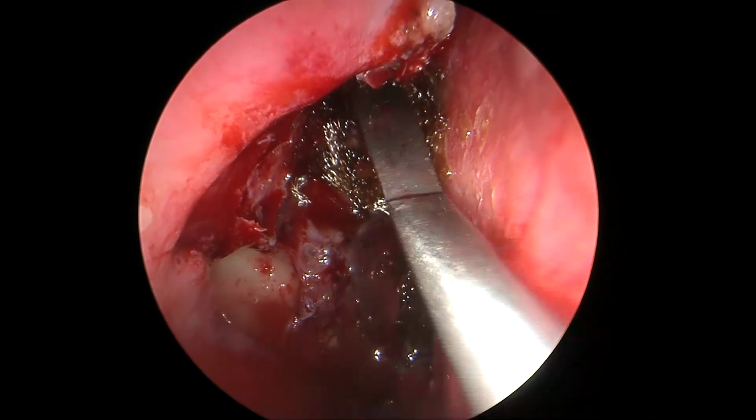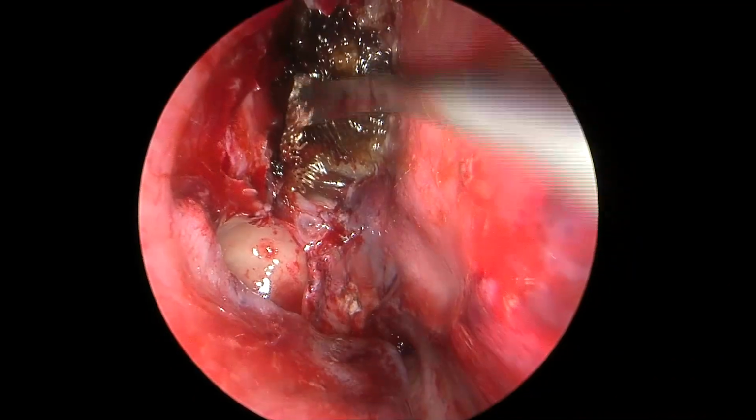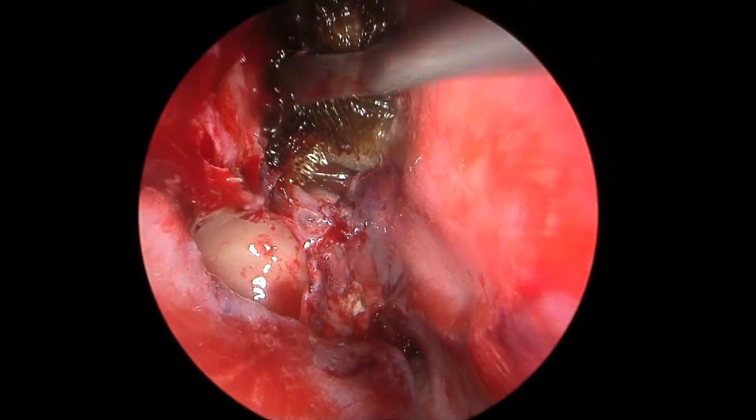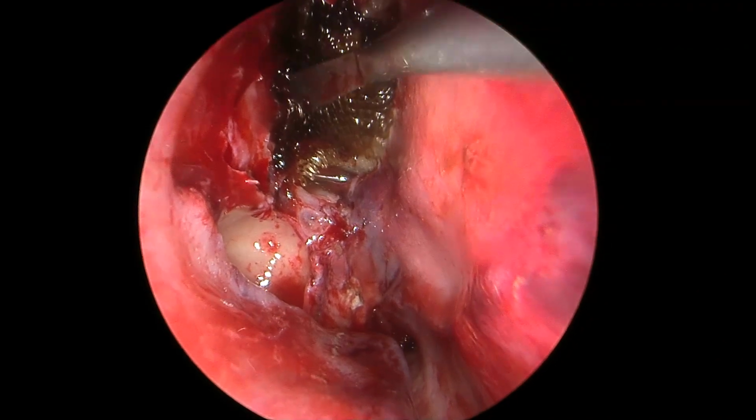So any part of fat that we use for skull base reconstruction has to be covered with either fascia or a free mucosal graft. This completes the end of surgery. A simple pack is placed here for 2 days, and the patient is planned for discharge after that.